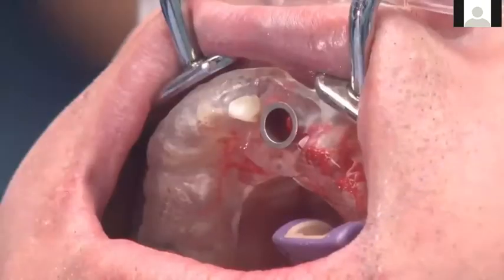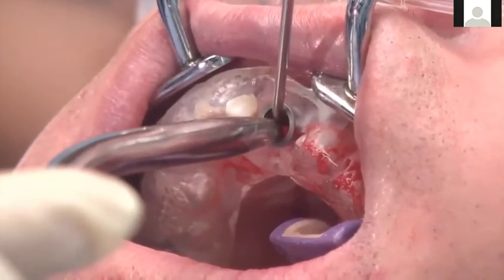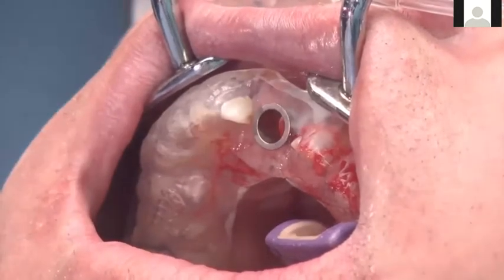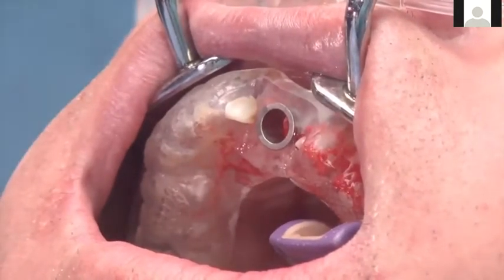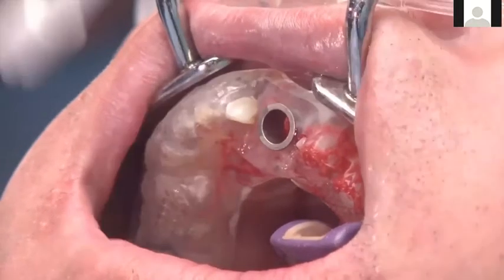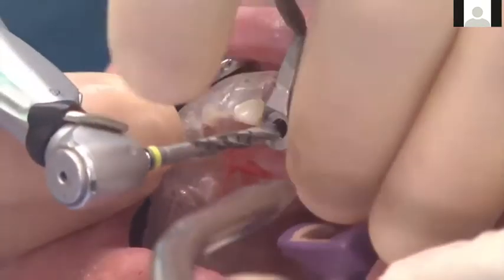So just don't go one drill after the other and try to rush it, because I've gotten a lot of cases as second opinions where people have really burned the bone because of guided surgery. But if you go between each osteotomy and rinse the site out really well, you can even remove the guide if you want. Take your time, you're in no rush. And if you do that, then you will not get into those situations.